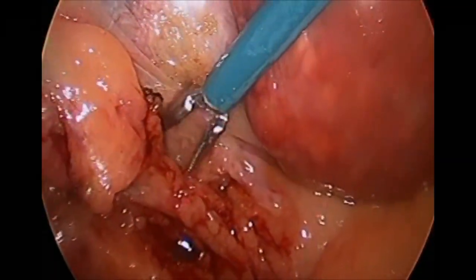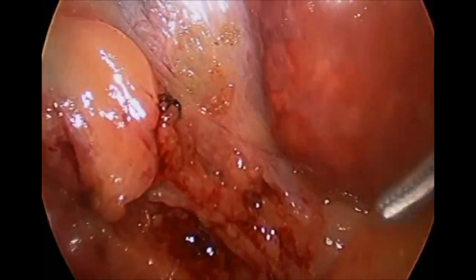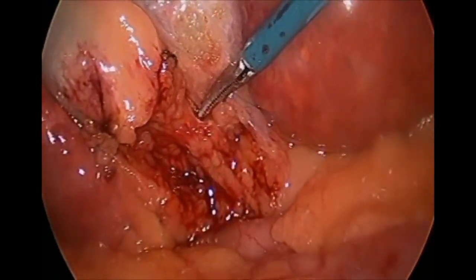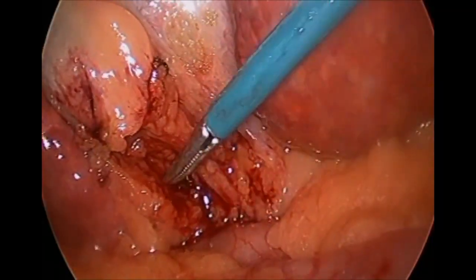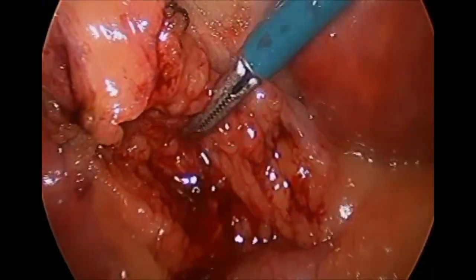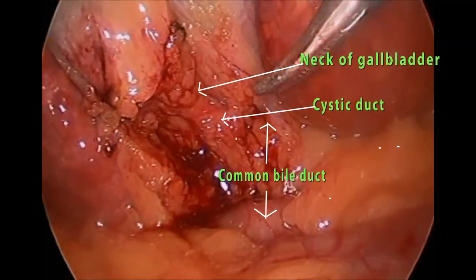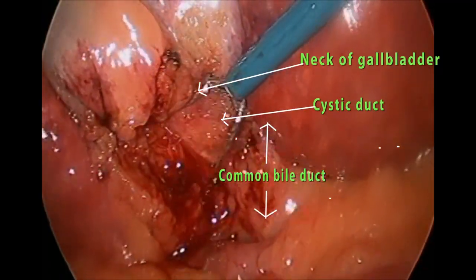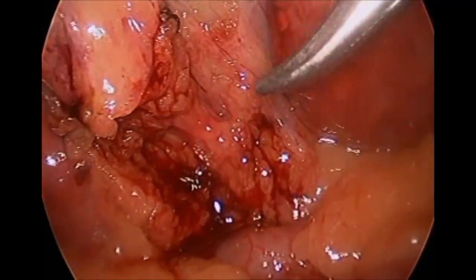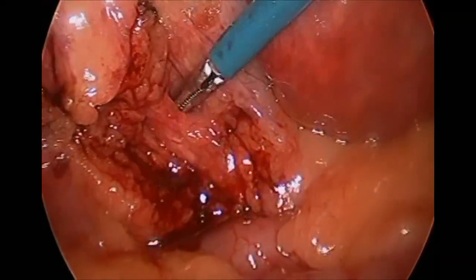Now we are slowly identifying the cystic duct, and as you can see here, a window is created between the cystic duct and the gallbladder. And also in these cirrhotic patients, they tend to bleed more than patients who do not have liver cirrhosis. Now we have just identified the connection between the neck of the gallbladder and the cystic duct.